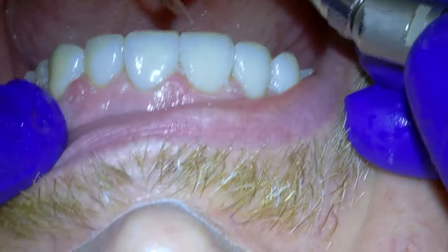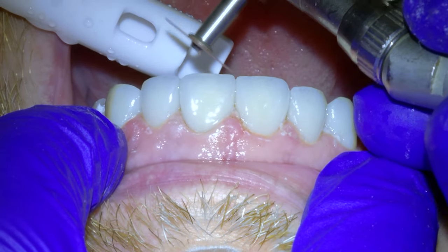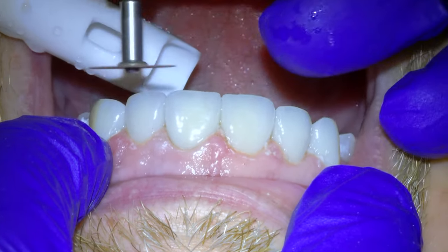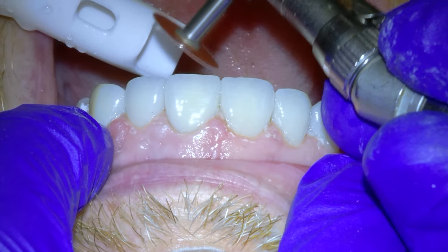Now some people really want white teeth, and we could have gotten them whiter if we were able to do more crowns on the teeth. But still, they are pretty white and don't stand out too much like they would if they were a little bit whiter.